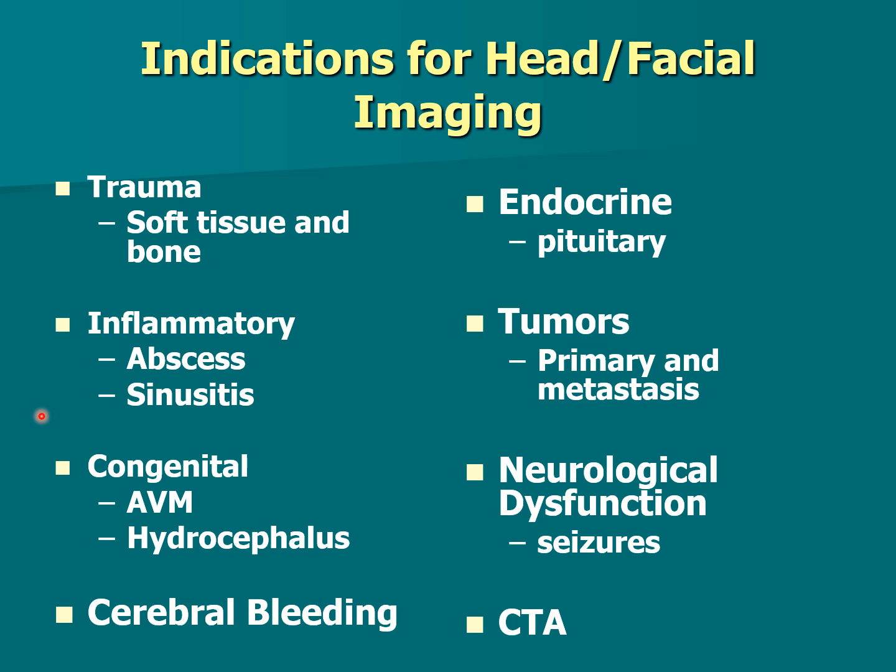Tumors of any kind, primary tumors, either benign or malignant, and metastatic lesions all through the brain or the spinal cord. And a neurological dysfunction. Well, we can't actually see seizures, but if a person has seizures, then we would scan them to see if there is any physical evidence of why they're having this, if there's a tumor pressing on something. Whereas if it's epilepsy, we couldn't necessarily show that, but we would rule out other things causing the seizures.